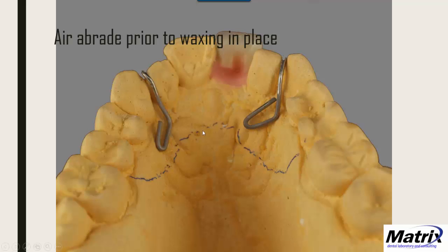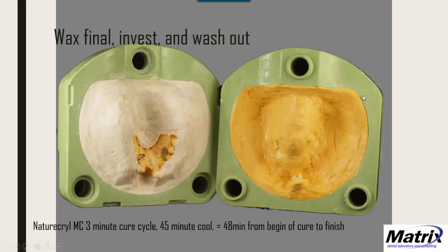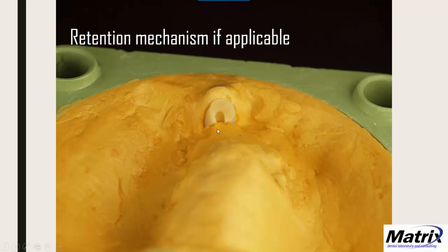I set the tooth and bent ball clasps over areas where they wouldn't interfere with occlusion, then air-abraded them prior to waxing into place. I outlined where the acrylic would go, then waxed, invested, and washed out. I use Nature-Cryl MC — Microwave Cure — which is a 3-minute cure, 45 minutes to cool, for 48 minutes total from cure to finish. It's as strong as heat-cured acrylic because it is heat-cured, just using the heat of a microwave and steam from the flask. I also put in a retention mechanism and coat with Palabond or Acropal bonding agent.